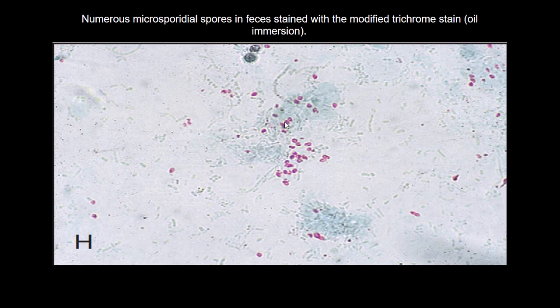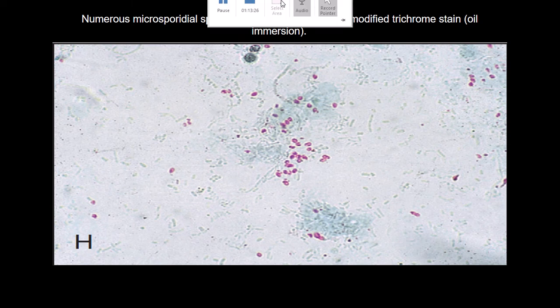The same thing can be applied for other protozoa, like the Microsporidium. Also can use fluorescinated antibodies for the identification of these protozoa in general.